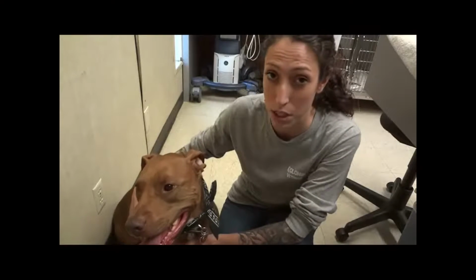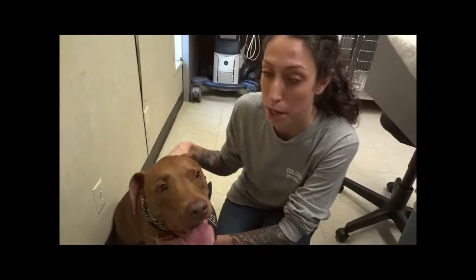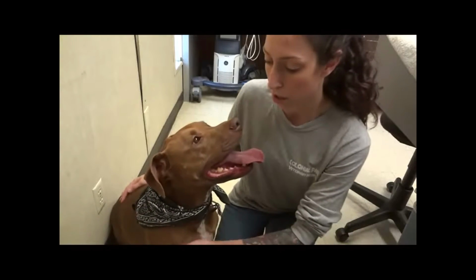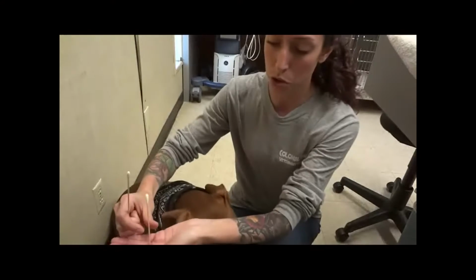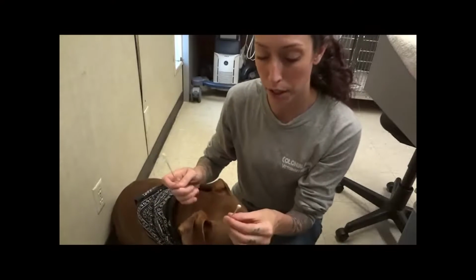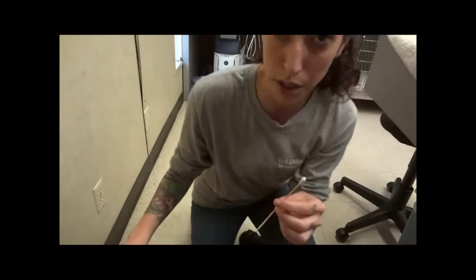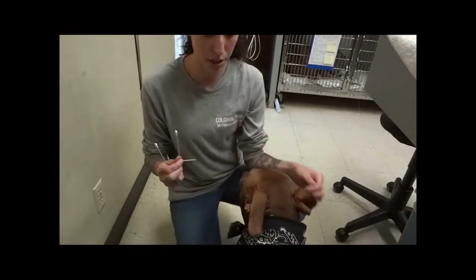Canine's ear for an ear cytology. We'll actually be using my dog. We went out to the lake and he's been shaking his head since we went out there. So, I've got 2 swabs, one for the right, one for the left. I've broken one of the Q-tips so that I know which one is the left ear and which one is the right ear.